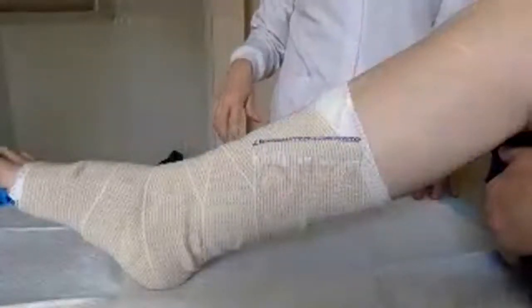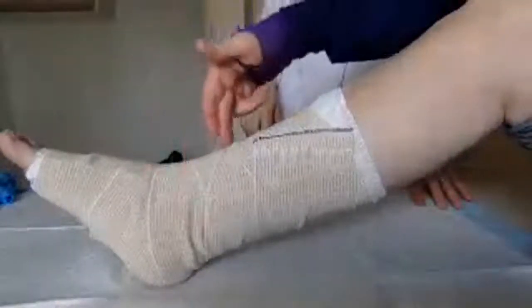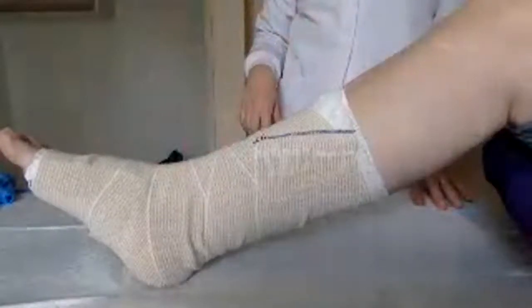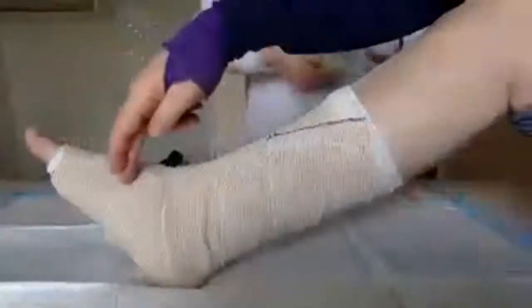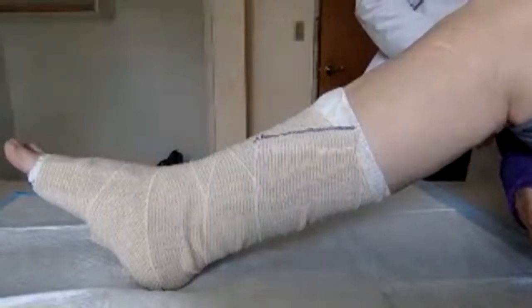The reason for this is it helps; if you just do a spiral wrap all the way up, when the patient starts walking, it starts landsliding down. So you want to continue to do a bit of the figure 8. When you get to the end, go ahead and attach that to the rest of the ace wrap there. And you'll see that we have kind of a zigzag pattern running here, and that tells you that you have it wrapped correctly. If you just go spiral like it is kind of down here when we get to the foot, then it will not stay up on the leg. It will come down unless you tape it, but we try to stay away from tape.